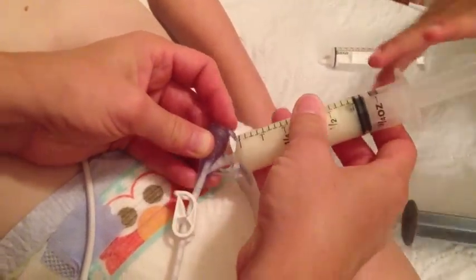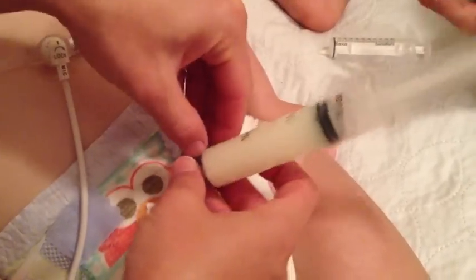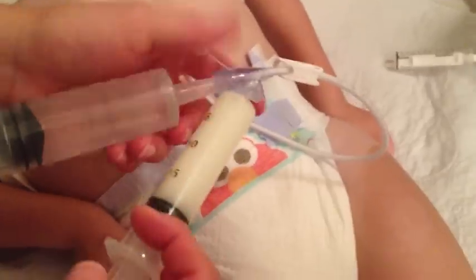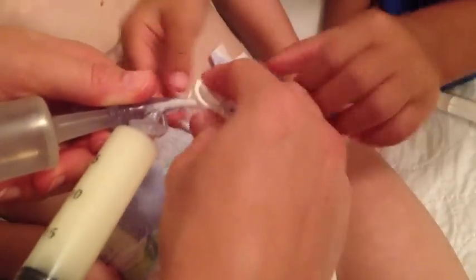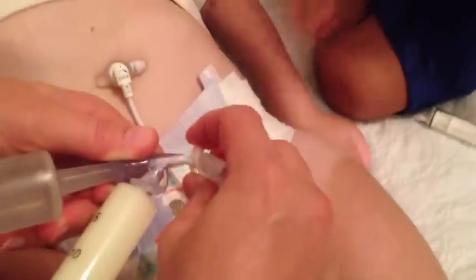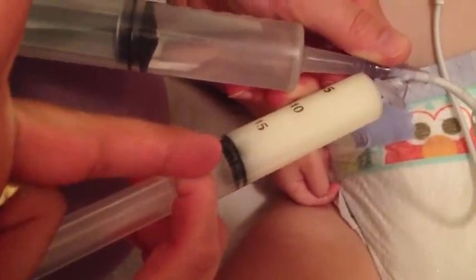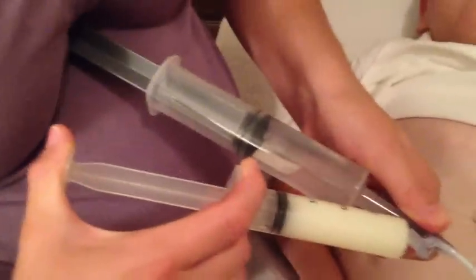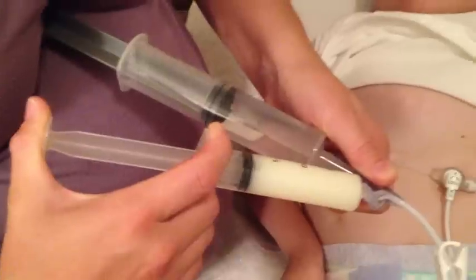Replace it with the solution that's been mixed with the powder. Also open the big port and put the water in at the same time — open the clamp. That helps dilute it and prevent any clogging in his tube. You're going to want to rock it to mix it up, because one of the medicines is a little more granular and can tend to clog it. Cheryl likes to put one up against her stomach for the water and use her hand with the other, pushing them simultaneously.